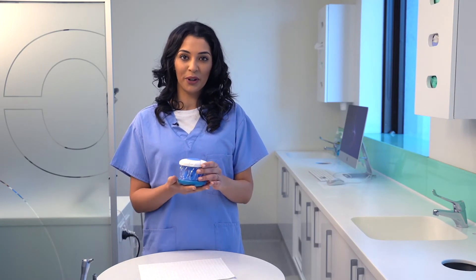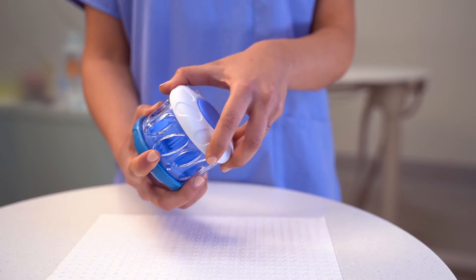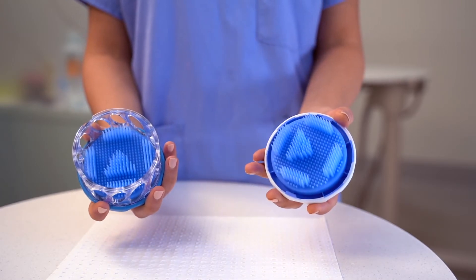To open your Dr. Mark's Hygiene, lightly grasp the blue bottom and the perforated body, turn the white top until it clicks, and lift the top off.